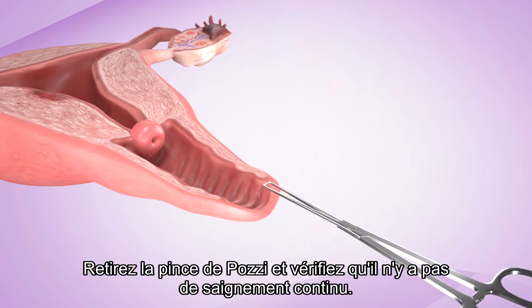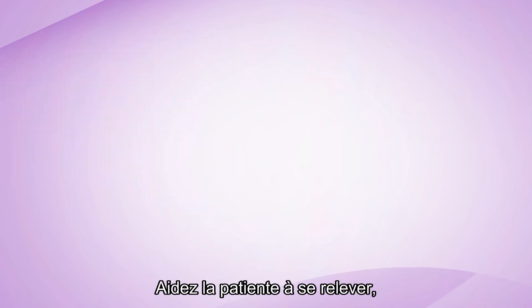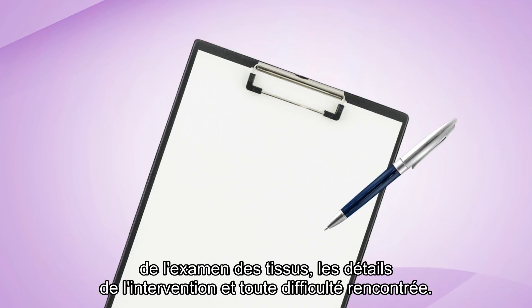Remove the tenaculum and make sure there is no ongoing bleeding. Help the patient up, escort her to recovery, and reassure her that the procedure is finished. Document the procedure, clearly entering details of the patient, date, time, findings on the tissue examination, details of the procedure, and any difficulties encountered.